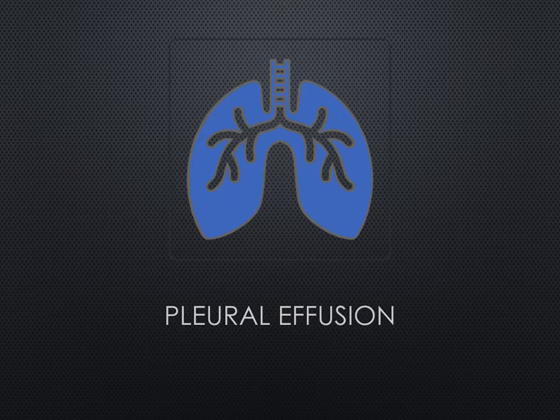poor sensitivity of chest x-rays, the differentiation between pleural effusion and consolidation can sometimes become a little bit more tricky, especially when there's some mixed pathology going on within those lower lung regions. This is where lung ultrasound can really come into its own.